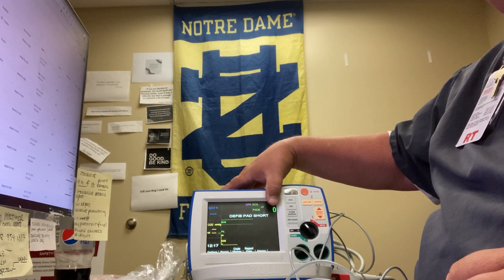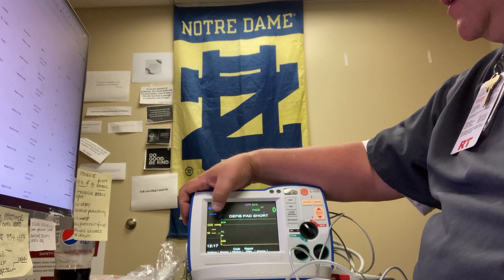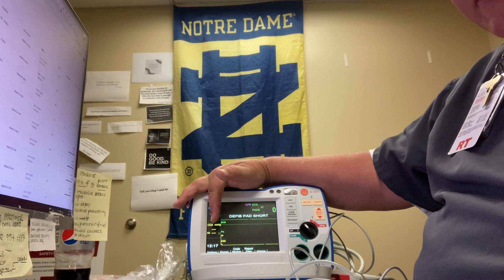It's going to say CO2 warm-up — it doesn't have to be calibrated. The CO2 warm-up goes for about two minutes. Your values will be displayed here to the left in millimeters of mercury: your CO2 value and your respiratory rate.